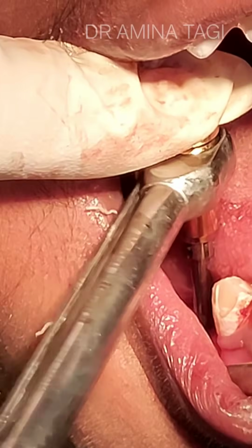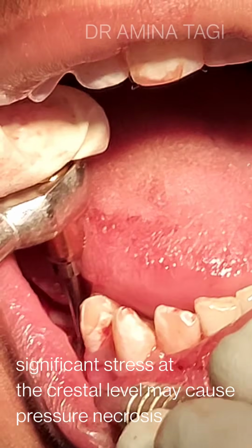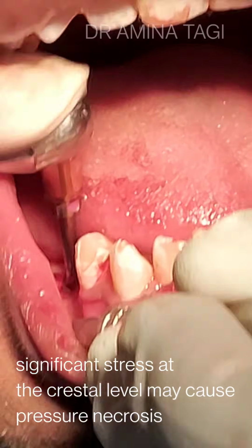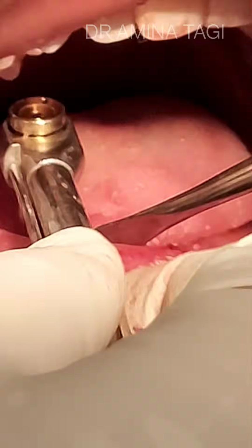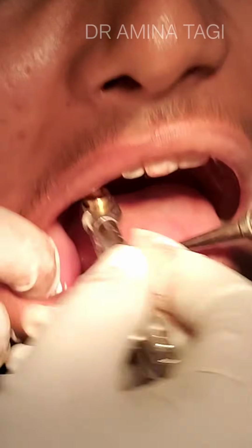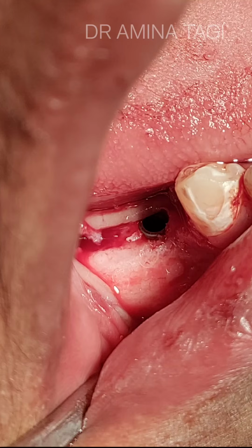That's the reason I didn't forcefully use the handpiece even after the implant was not fully embedded, and I've used this ratchet so that I can have a better control of the grasp. So this is the crestal level ultimately. You can see it in the picture.